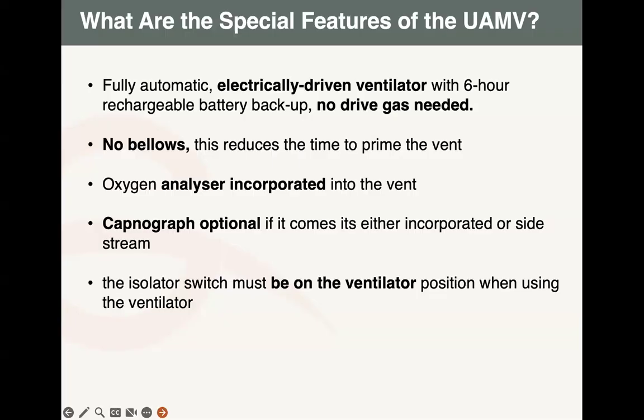If on your initial purchase there was no capnograph, you can still contact our technician, and then they will give you what is needed for you to acquire the capnograph if you do not have one. So a capnograph is really needed in modern anesthesia so that you do good ventilation to your patient. Remember, we are talking about ventilation, so eliminating carbon dioxide is one of the targets that you want to achieve.